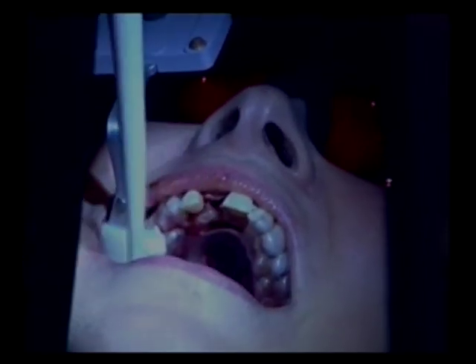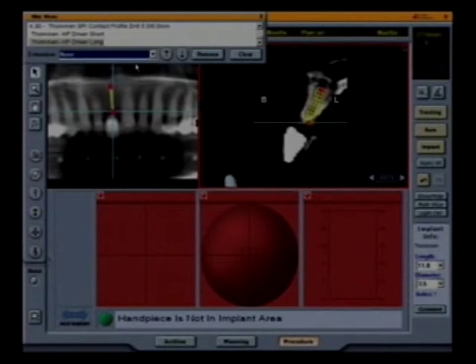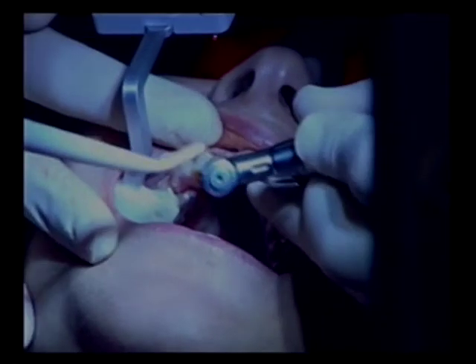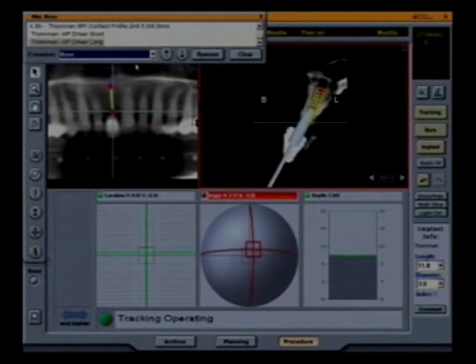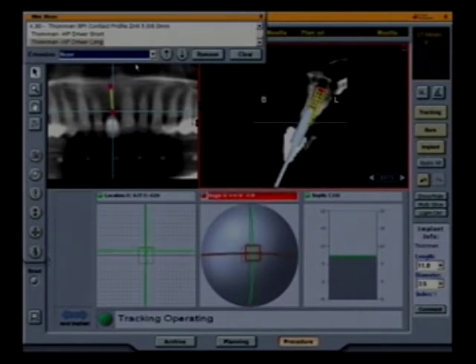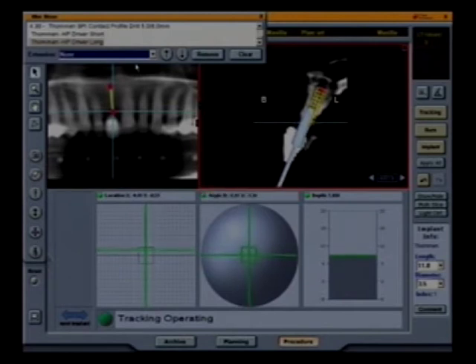Tighten the implant — 11 millimeter, 4.0 diameter implant. Even as we're placing an osteotomy, if you start to tilt this way and drive it in soft bone, you can actually still direct that implant off your original plan. As I say, it makes you a much more precise practitioner.